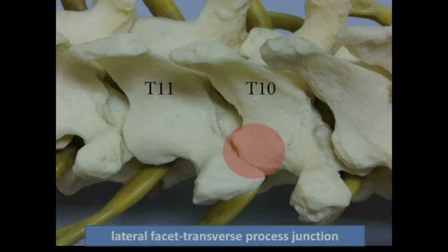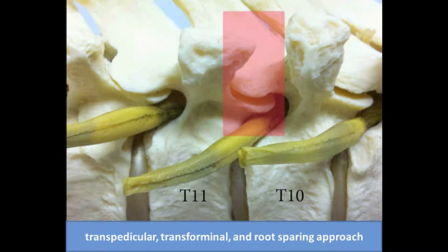A midline skin incision was made. A tubular retractor was docked on the indicated facet complex. The transpedicular approach was used, and costal transversectomy was not needed.